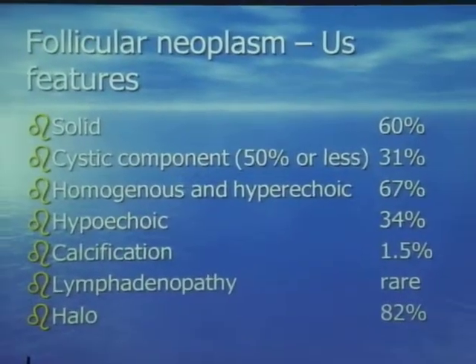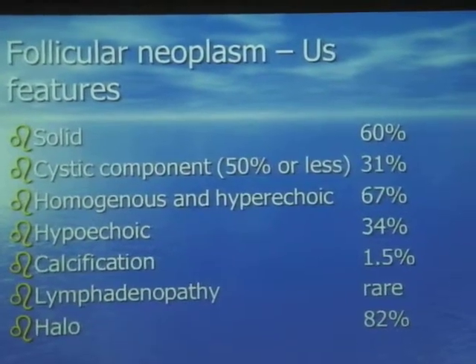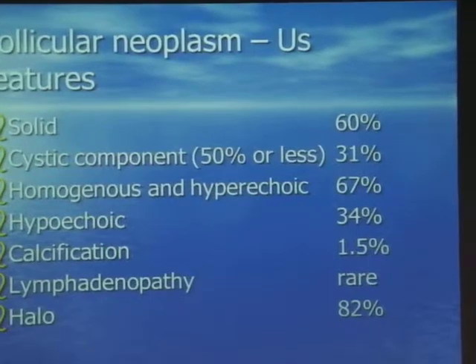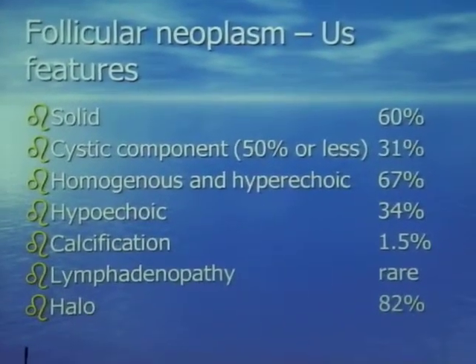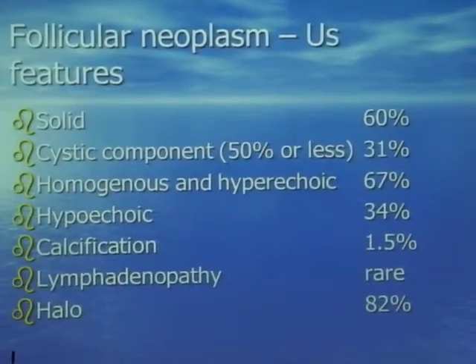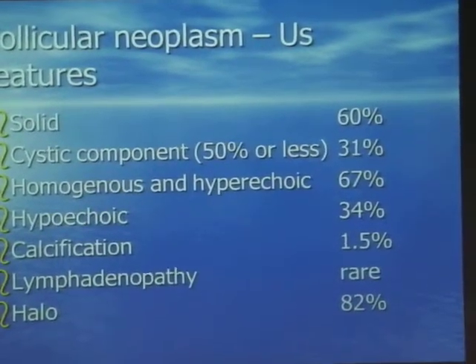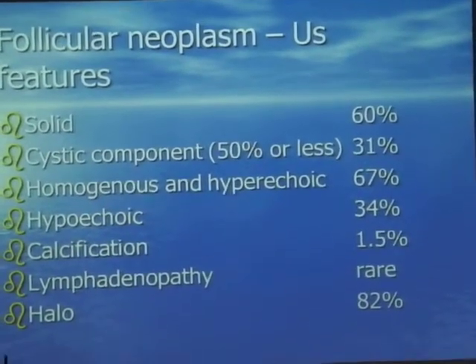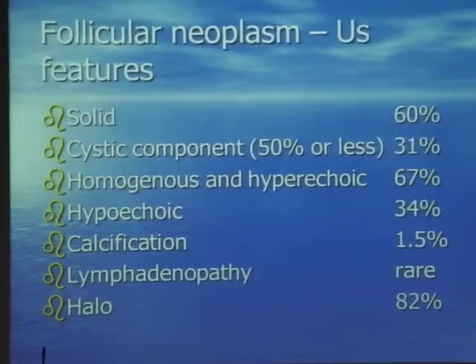So all the nodules that we've seen so far, multinodular goiter nodules, papillary carcinoma nodules, anaplastic, medullary, all are dark nodules. The only thing that is bright, just to bring you back, is the papillary carcinoma lymph nodes, right? Okay? But when you deal with an echogenic nodule, that pushes you towards a follicular lesion. Okay, that's one of the few lesions that appear echogenic on ultrasound. So this is what you see in a follicular lesion. All right.